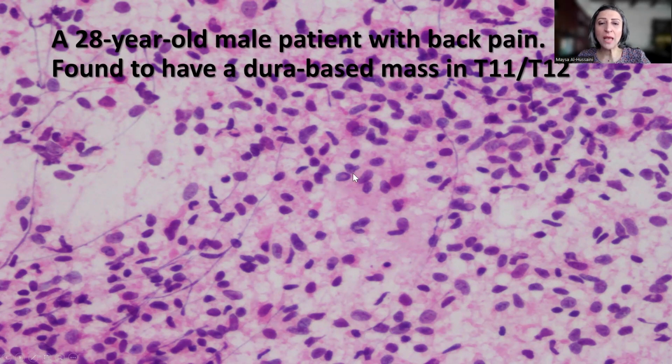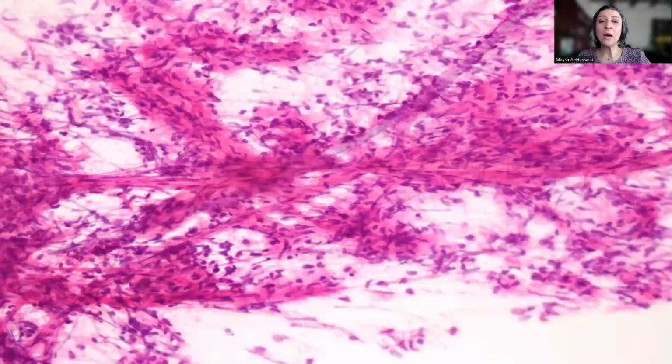Now, I don't know if you will be able to see this one, but this nucleus contained an intranuclear inclusion. And the thought at that time was that this probably can represent meningioma.